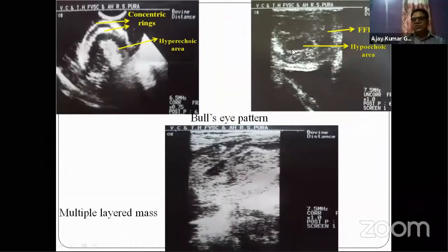These are the typical patterns of intussusception, which I told you normally are not detected when you perform trans-abdominal ultrasonography. It is very rare that you will detect these patterns unless the intussusception mass is very close to the abdominal wall. Otherwise, just for your academic purpose or satisfaction, you can palpate the intussusception rectally in those cases in which it can be palpated, as in non-pregnant animals. You can bring them close to the flank and then scan them trans-abdominally. And this will be the pattern.